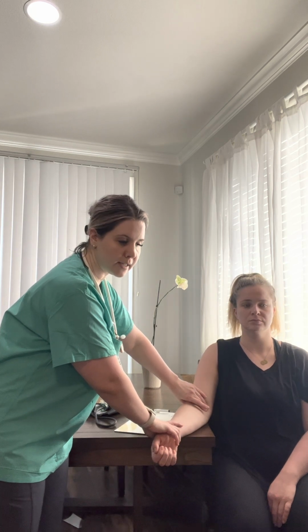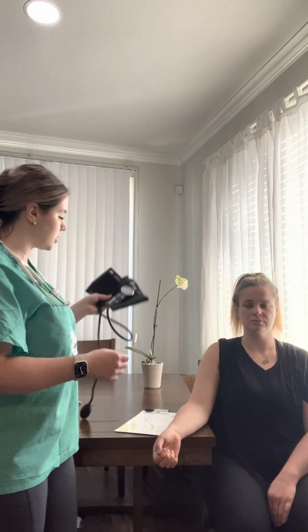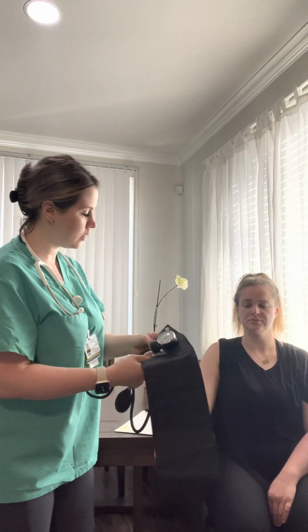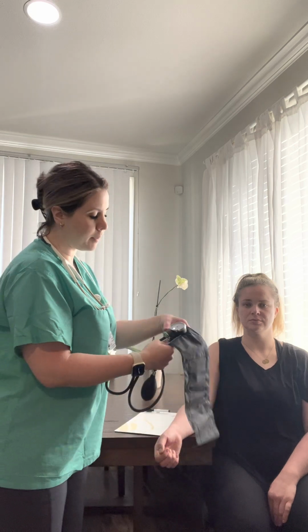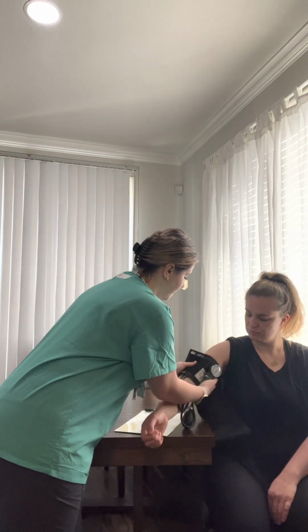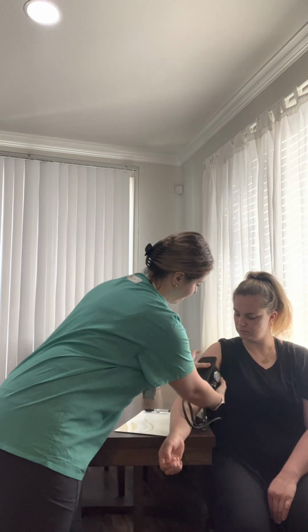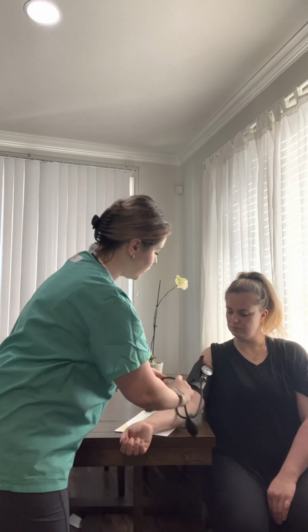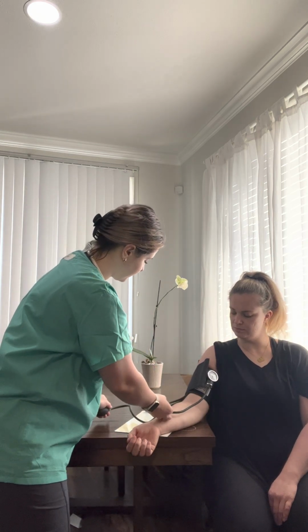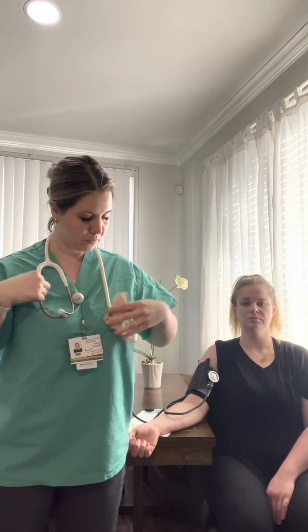Once the brachial artery is identified, we're going to grab our cuff. We're going to make sure that it's the correct size for the patient, which this one is. We're going to place the cuff 1 inch above the brachial artery and make sure that the pointers are pointing towards the brachial artery. Once we have placed the pressure cuff onto our patient, we're going to make sure that it's untangled. We're also going to sanitize our stethoscope.